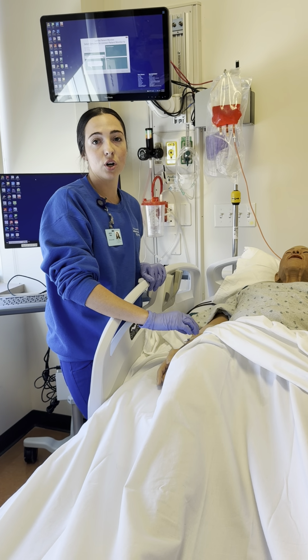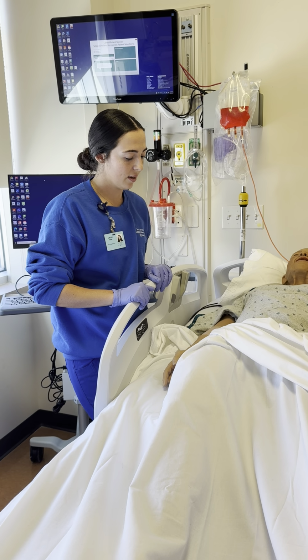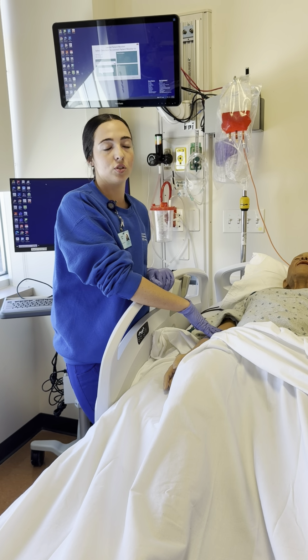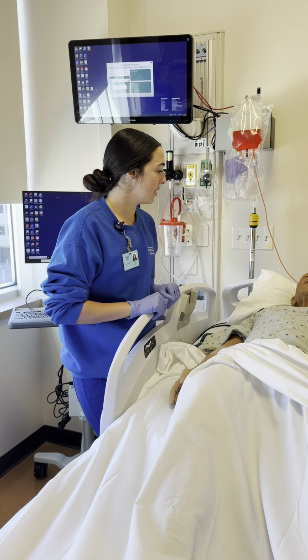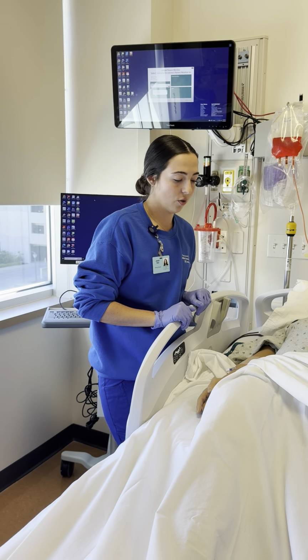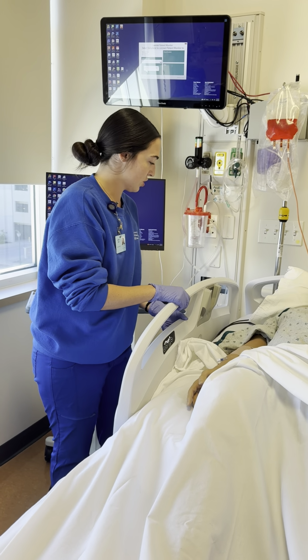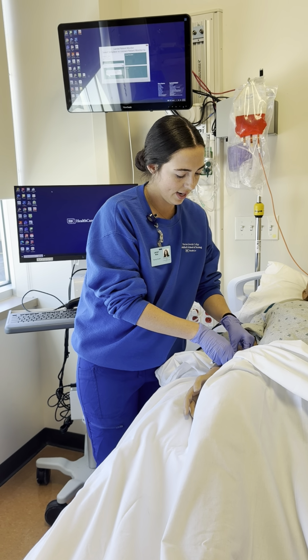I'm going to give it to her right now via IV push. We're going to do this one time, and then this is to help treat her gastroenteritis. So I'm going to make sure that I document everything that I've told you today before I leave, okay? So we're going to go ahead and get started. I'm just going to drop this side down, make sure we've got everything ready.